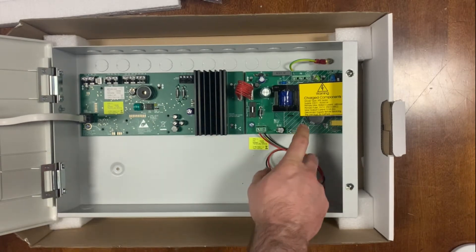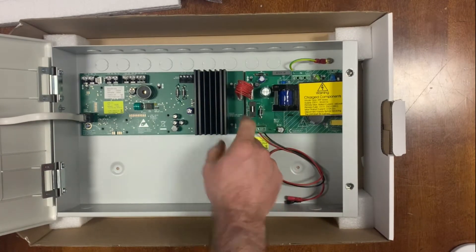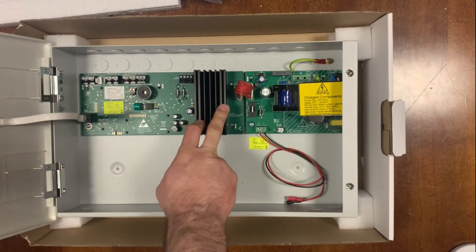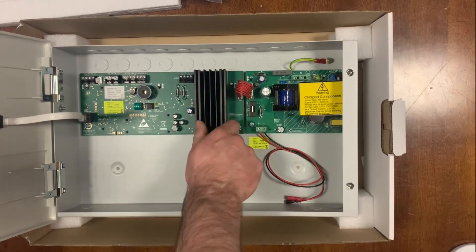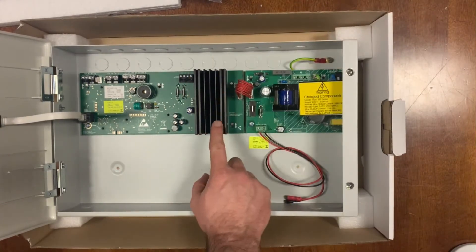So this is your power supply unit — your mains comes in here. These are actually modular, so if you ever do have an issue and need to change out a power supply or change out the main processor, you just undo these screws and they clip off.